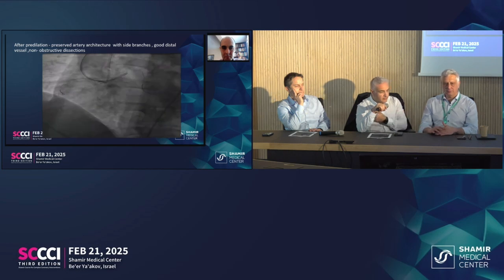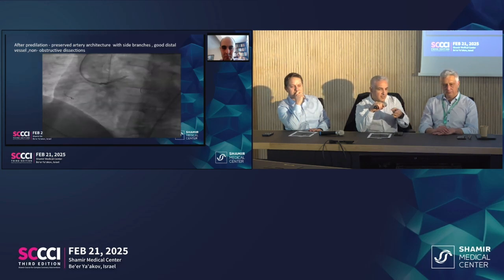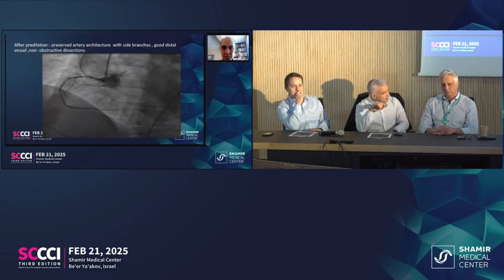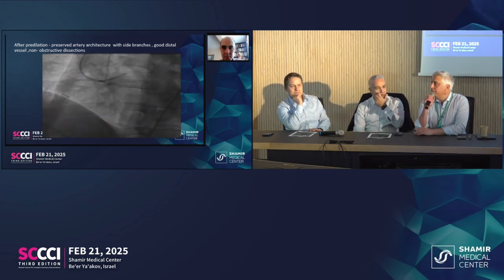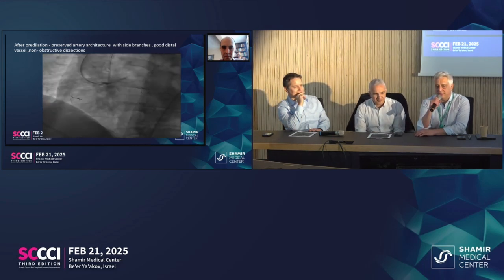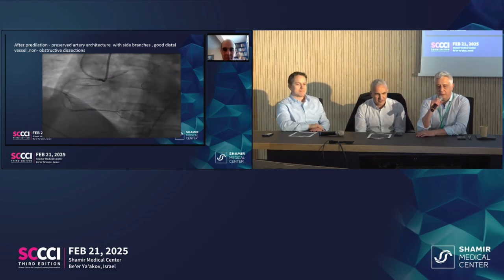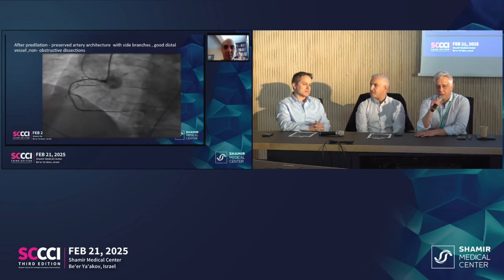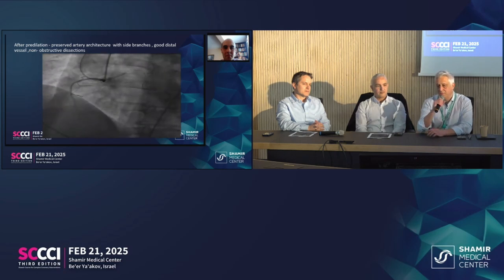So in this case, I fully agree with Lior. I mean, imaging is okay. You can do it if you want to. You have a price to pay sometimes. But I don't see how you get away without stenting the distal part and then going up. So although the audience supports imaging, the panel supports stenting the dissected segment of the artery, maybe all the length up to the ostium, like a DES metal jacket. So what did you do?